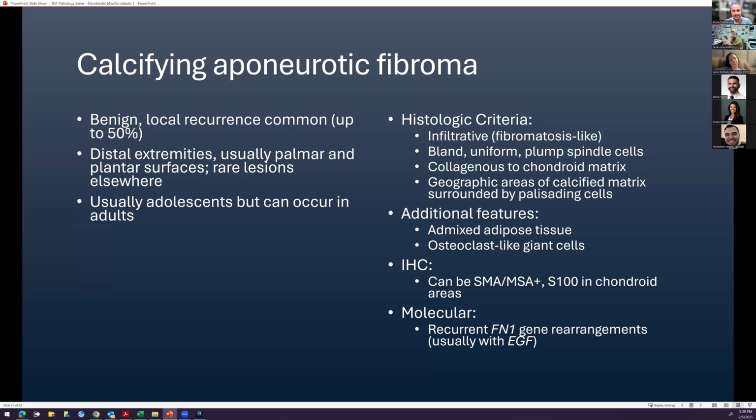You won't really have those calcifications in there, right? So other things you might consider, like pseudogout. Tophaceous pseudogout will look like calcifications, but they're actually crystal deposition, right? So think about that. Synovial chondromatosis, if this is around the joint, you might wonder about that.